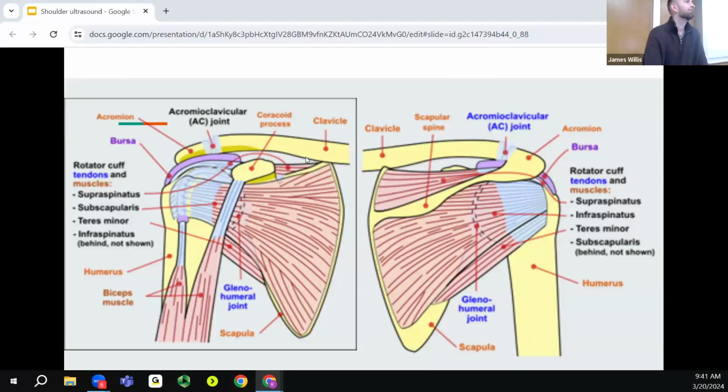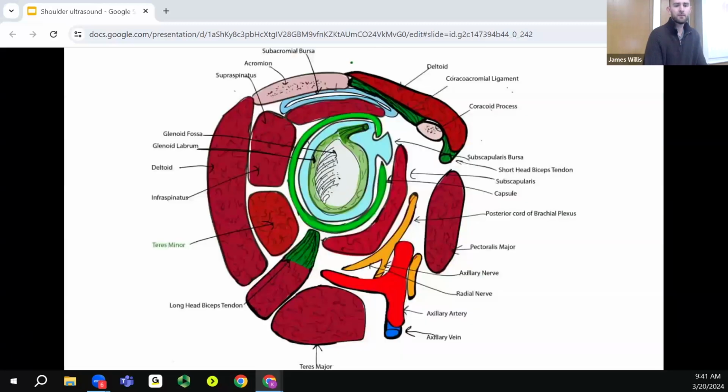Point out there's no muscle inferior, right down here. So our most common dislocation site is going to be anterior, where the head slips under these muscles, compared to posterior, which really only happens in a few cases, and it's pretty difficult to do. Here's a straight-on view of the muscles again. Here we have the supraspinatus, infraspinatus, and then down here we have teres minor, subscapularis. And then just picture a pocket here where the shoulder dips into.